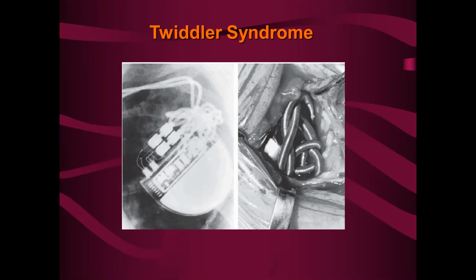And eventually it just ties such a great knot on the lead wire. Not only does it pull back, but it's all kinked into little knots. And so this wire is totally not usable, right? So the system needs to be replaced in such instances. So that's why we tell them, please don't massage the pocket, don't touch it. If it's itchy, just try and tap lightly on it.